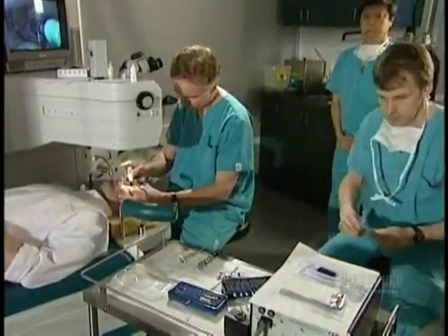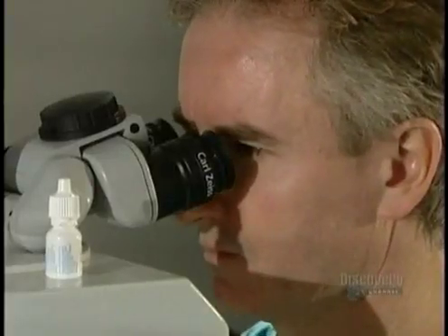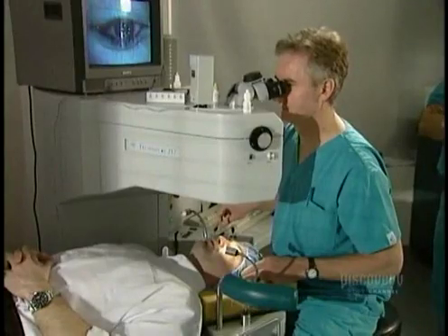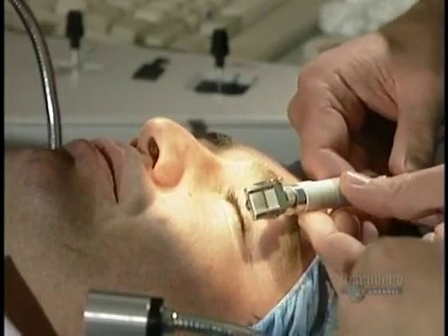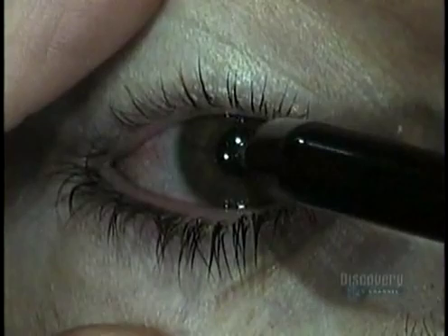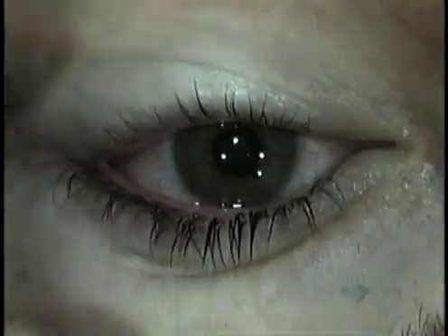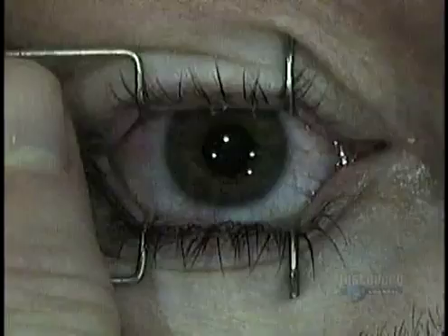The surgeon administers a few more anesthetic drops, then inspects the microkeratome — the device he'll use to lift a very thin layer from the outer surface of the eye. He also measures the patient's cornea using an ultrasonic instrument. The cornea must be a minimum thickness for it to be safely reshaped.